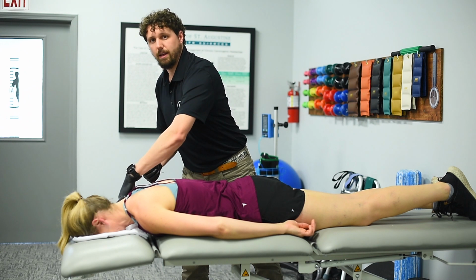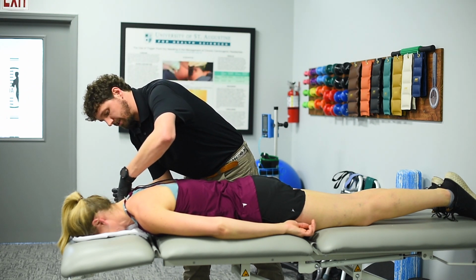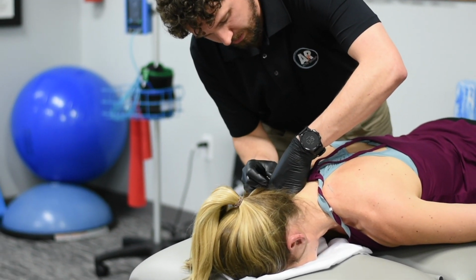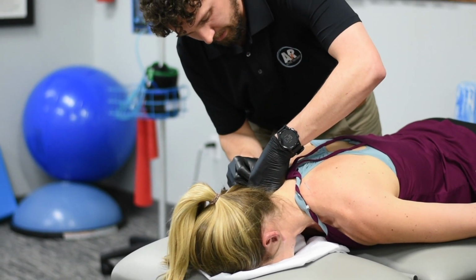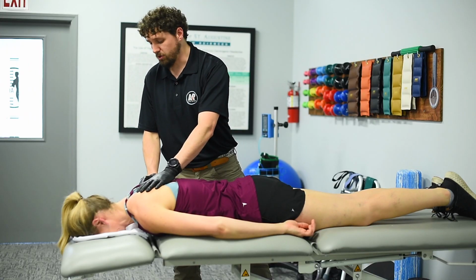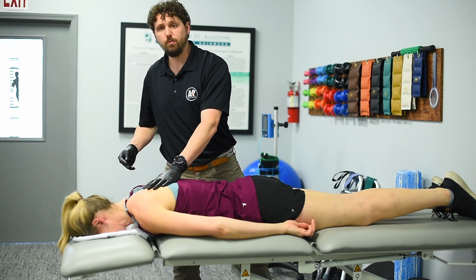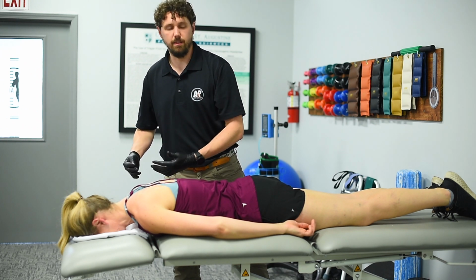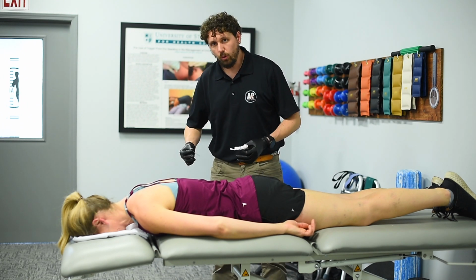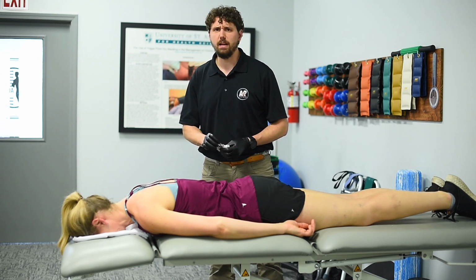I find out where that tender spot is, or where that trigger point might be, and I just go after it. For this one, we'll find our spot there and just let it hang out. Once the needles are in, you might know that they're there, but there isn't too much discomfort associated with them just sitting there. When you release the trigger point, it can feel like a mini Charlie horse. It hits and goes away, so there's a little bit of soreness from that, but typically not too bad.